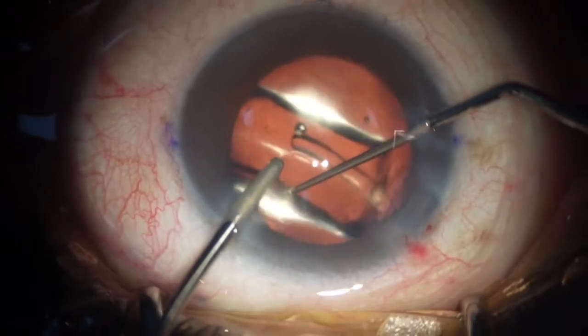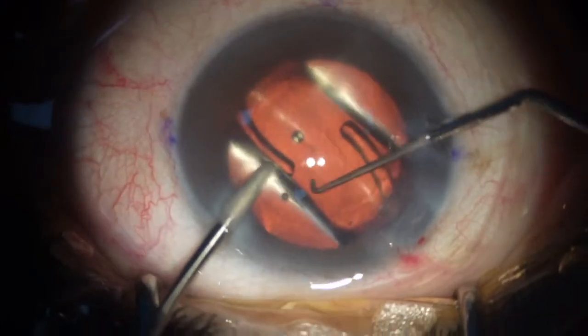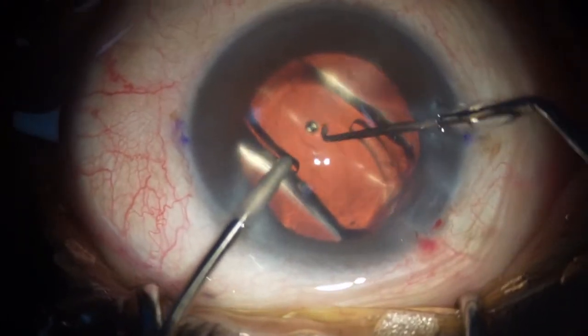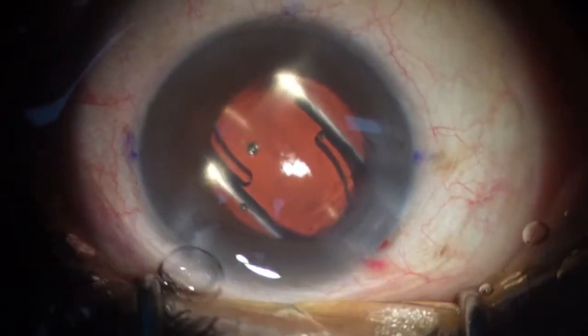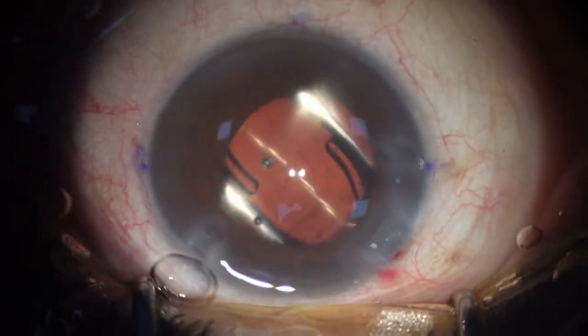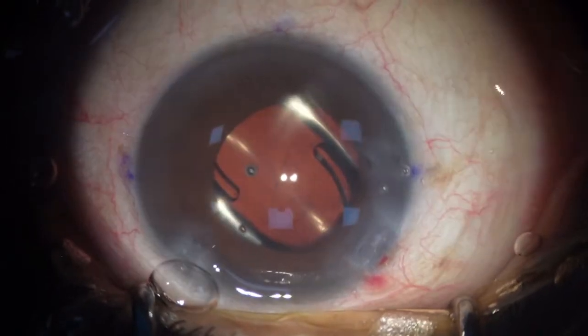Sir, we are shifting over to Dr. Rajendra Prasad. I'll just position the IOL. Thank you so much. Hello, thank you. Admission to OT1.